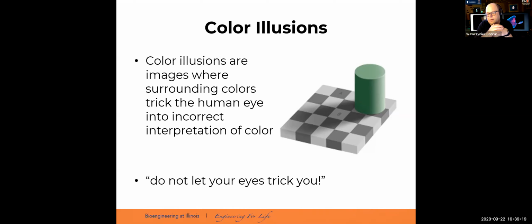So I've got another kind of illusion later in the semester, where you will see an older man with very, I'd say, flexible skin, and there is an image, actually a CT image, which shows that when this skin flaps, it creates an artificial shadow on the CT image. So this could be an example like this.